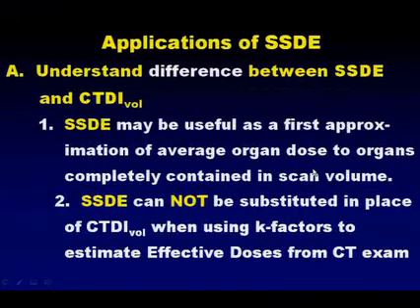Important point. Do not, under any circumstance, substitute SSDE for CTDI vol when you use the standard K factors to estimate the effective dose from a CT exam. All those K factors were established and published based upon either the CTDI vol from the 16 centimeter phantom or the 32 centimeter CTDI phantom. And so we cannot substitute SSDE for that.